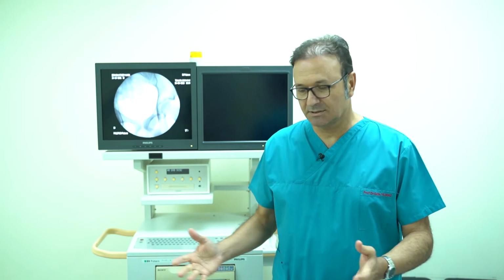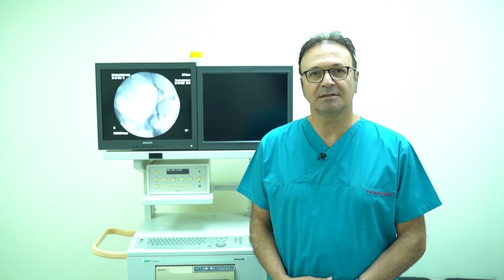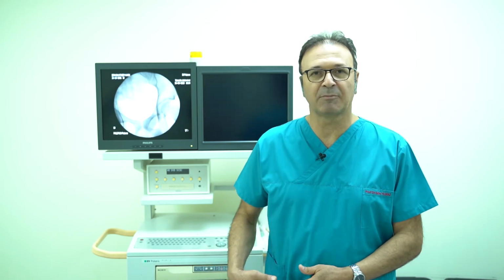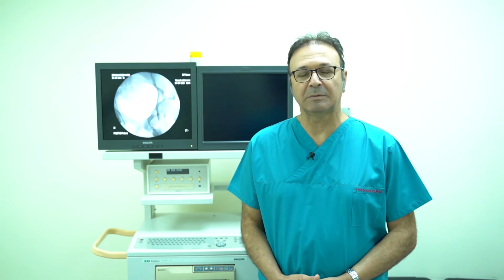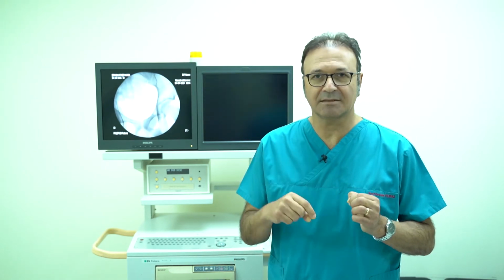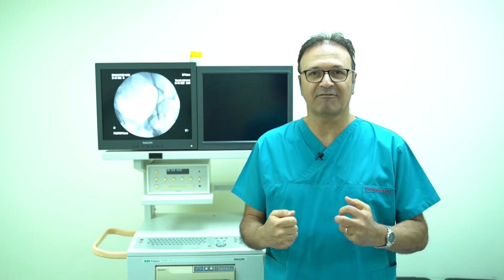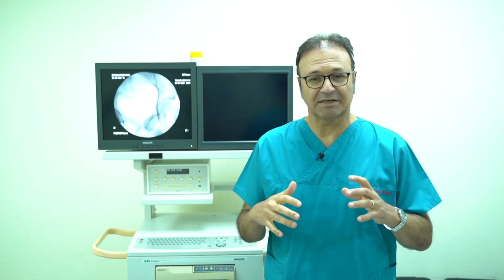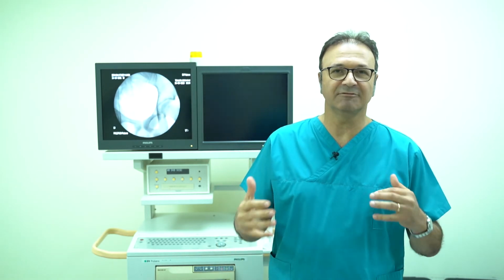We put the patient on the angiography table, and under ultrasound guidance, we puncture either the femoral vein or the axillary vein. Then we put a catheter, and we search for the refluxing vein, trying to identify which vessel is responsible for the occurrence of varicocele.